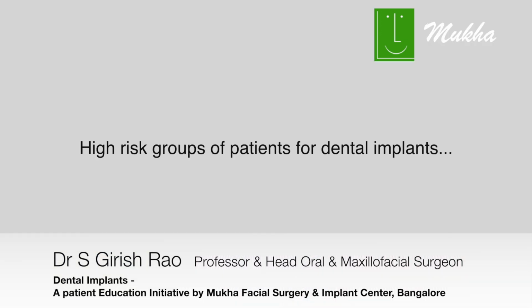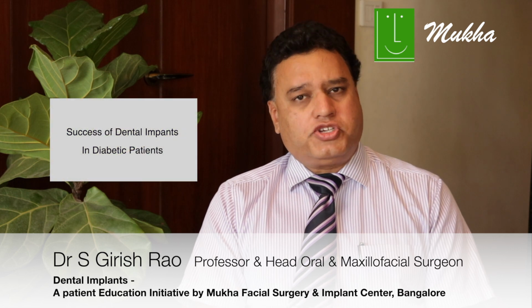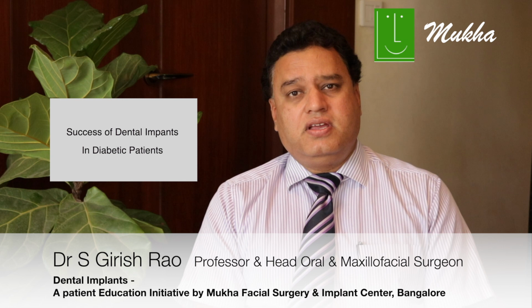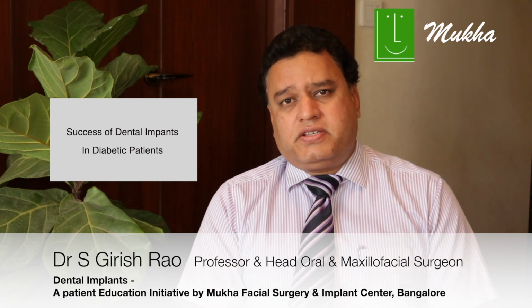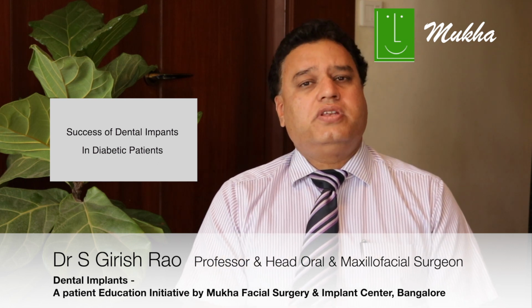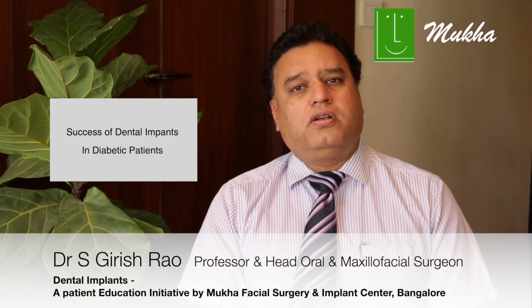Can dental implants be done for medically compromised patients? One condition I can definitely mention is diabetes, especially poorly controlled diabetes. There the implants may not get integrated into the bone. In well-controlled diabetics, yes, you can definitely do it, but the success of osseointegration may be slightly less than in the general population who do not have diabetes.